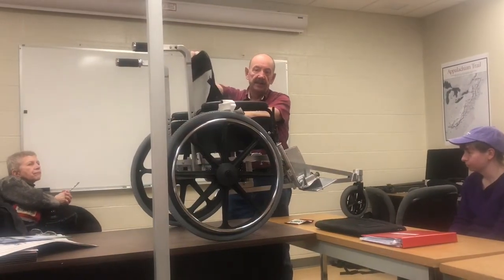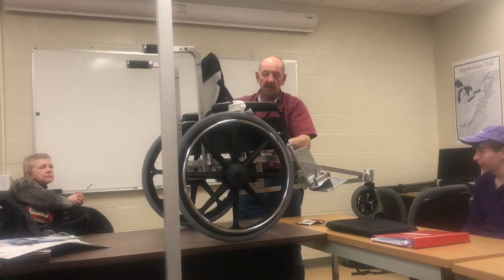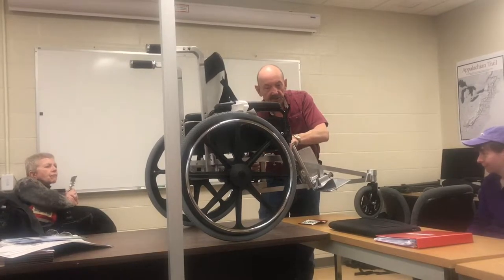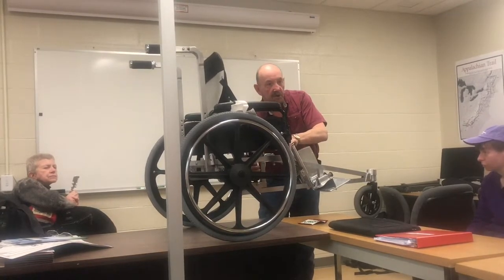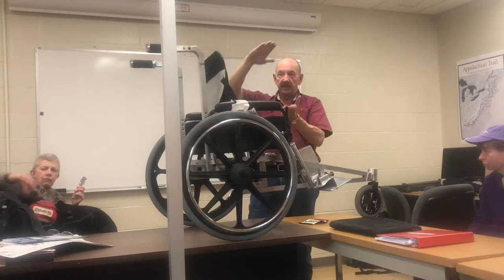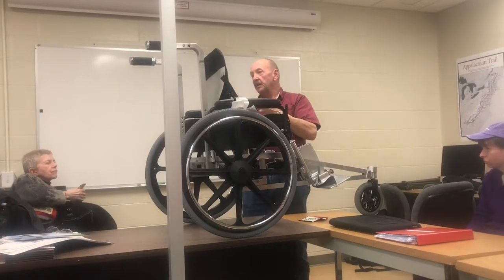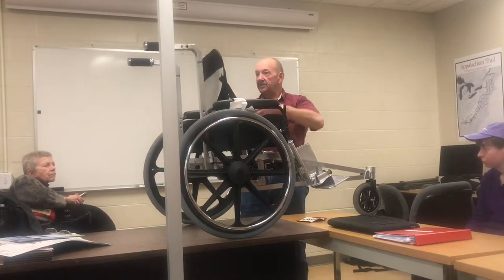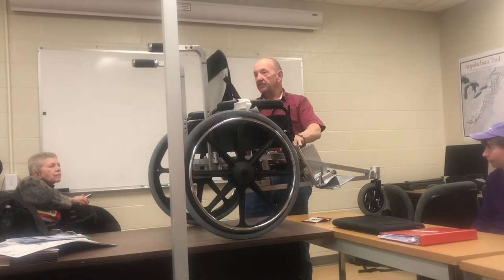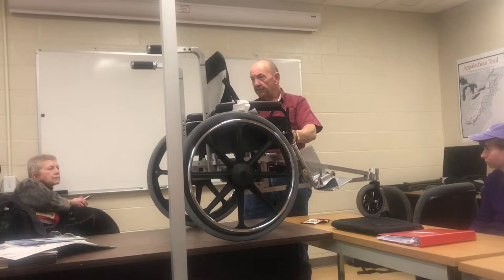The seat is adjustable in tilt and also in height. The height of the seat is adjusted using the coil spring on the shock absorber. If you tighten the spring and compress it, the seat is automatically going to go down. If you loosen it and expand it, the seat is going to go up. You can adjust the seat height, and once you've adjusted it, it doesn't change the level of cushion potential.